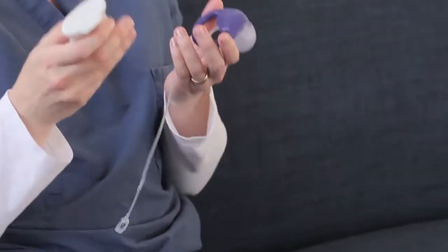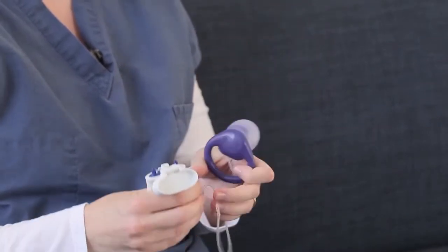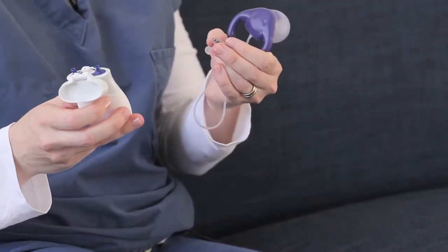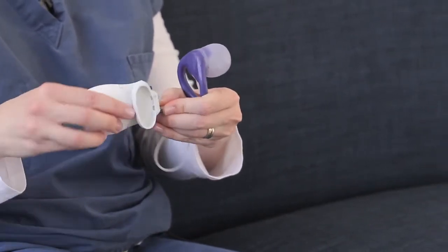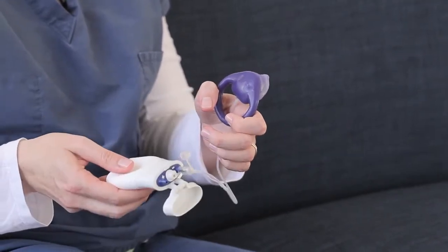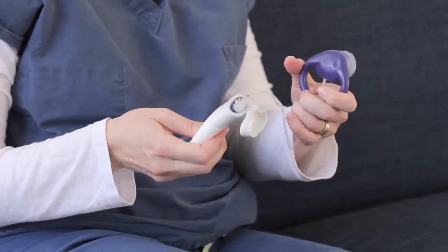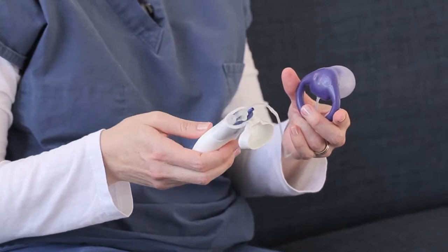So the system includes a pump, which allows you to control the air that's in the balloon. It attaches to the valve, and in order to deflate the balloon, you attach the negative port and squeeze it a couple times until the pump becomes concave. To inflate the balloon, you attach the valve to the positive port and give it 7 to 10 slow, steady squeezes.